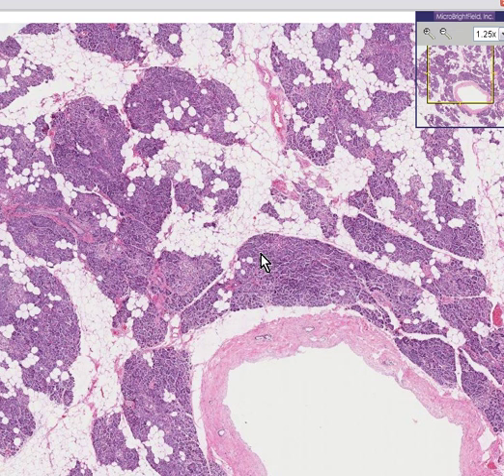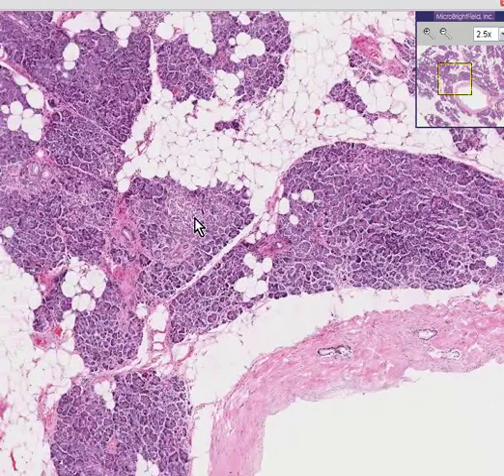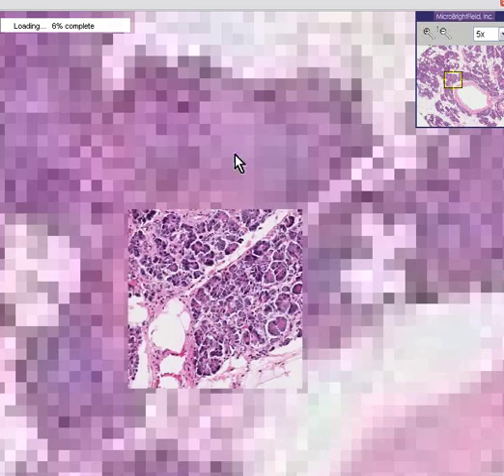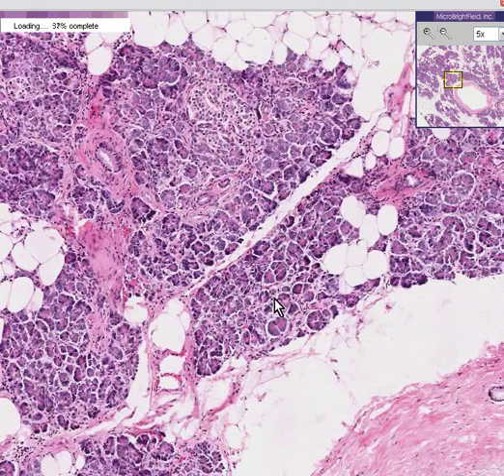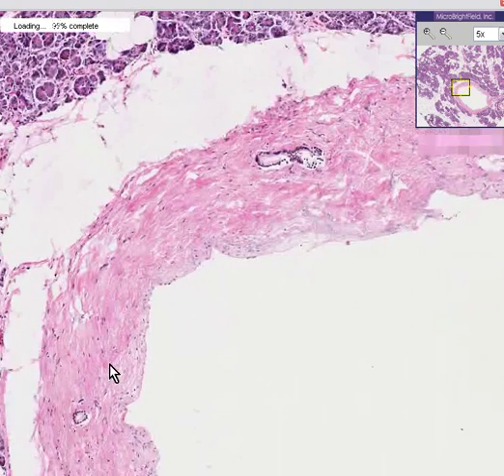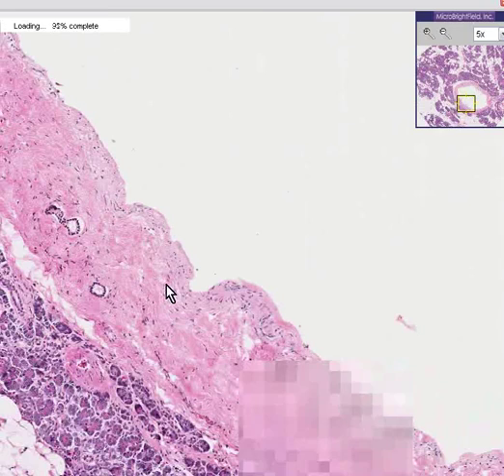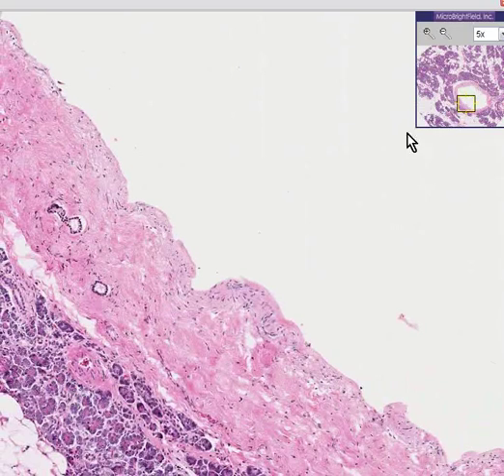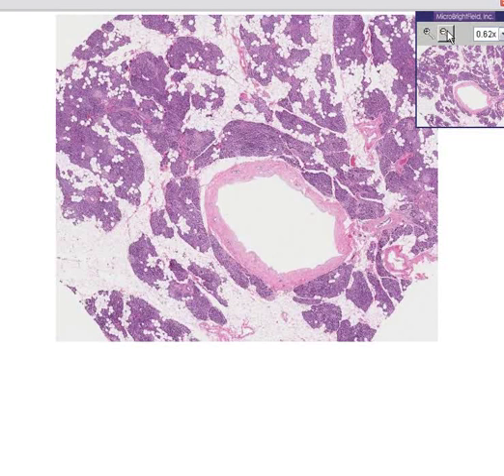Notice that the pancreas lobules and acini look pretty good. Notice that the islets look pretty good. Notice that we have a main pancreatic duct here which looks pretty good. The only abnormality in this pancreas is that half of it is fat. Thank you very much.